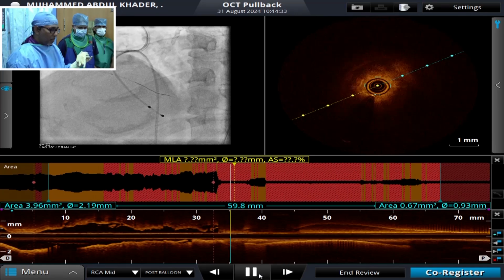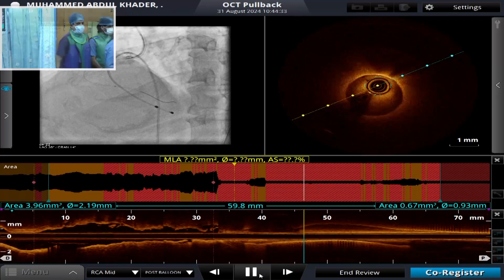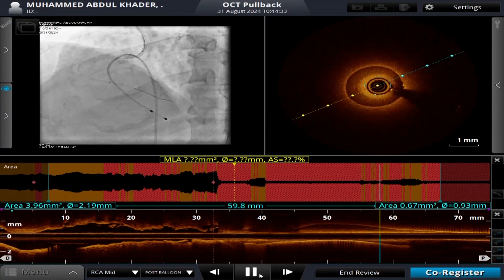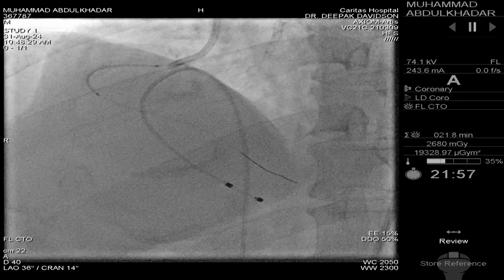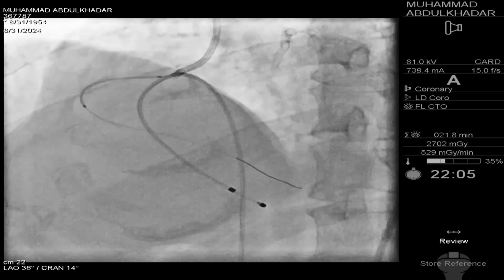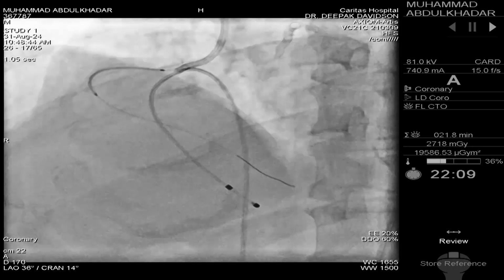That's it. So we'll stent. Okay. Now highlight. Enlarge the fluoro screen. Yeah, in the intima and media. It's almost reaching the media, right? What you saw there. Okay, we'll go ahead. Vishnu, we'll go ahead. Yeah, we are seeing dissection, and probably this is cut into the media also. The position.